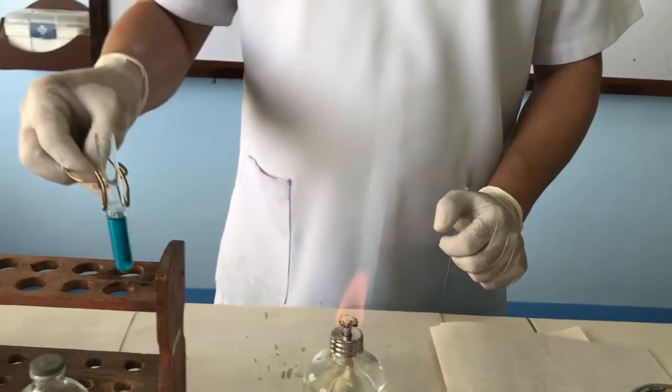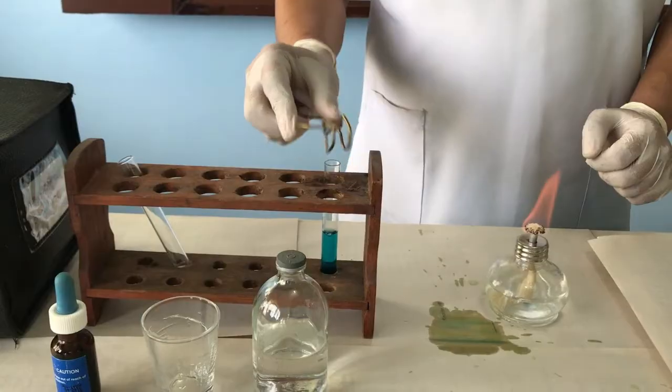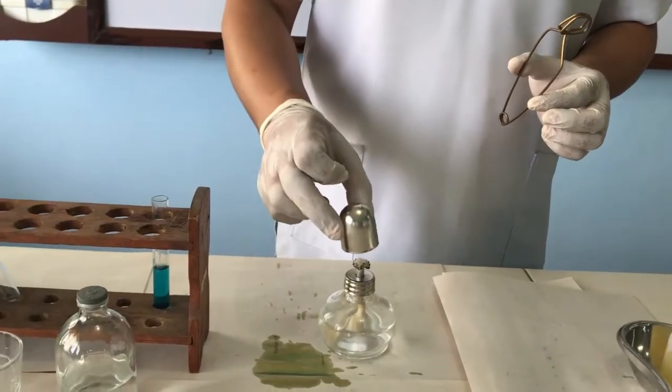Remove the test tube from the flame and put out the flame. Allow the urine specimen to stand for one minute.